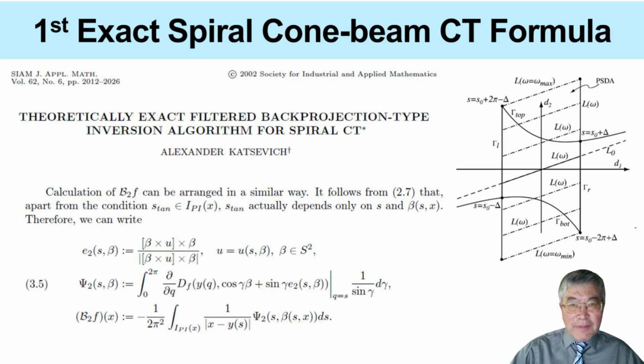We started from parallel beam CT, then moved to fan beam CT, then cone beam CT, and finally spiral cone beam CT. Along the way, we used several viewpoints: impulse functions, Fourier analysis, weak perspective, obliqueness correction, the Fourier slice theorem, and the Orlov theorem.